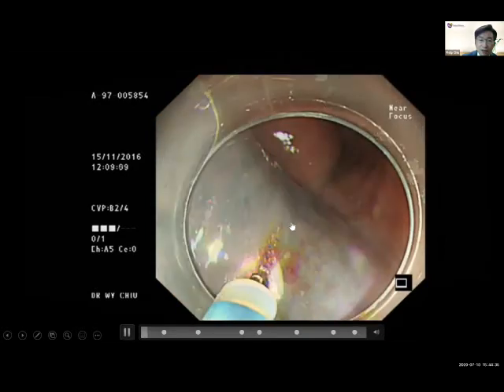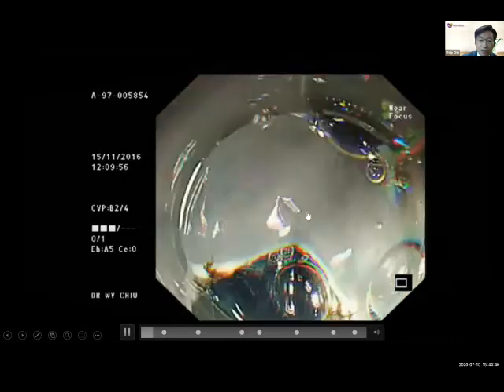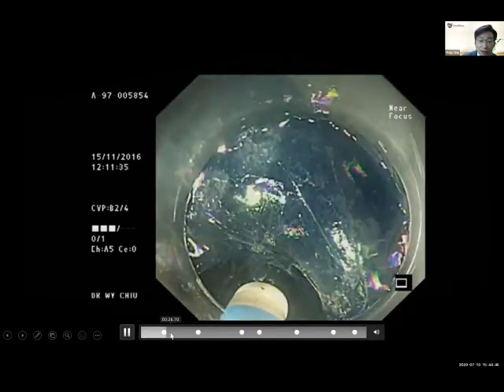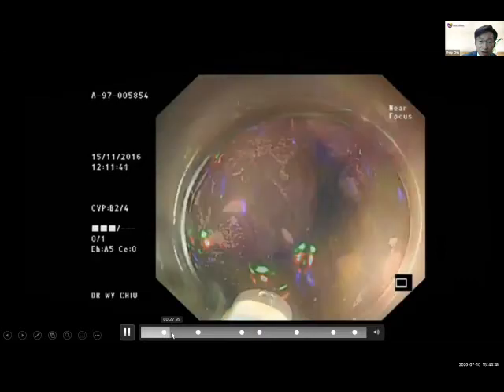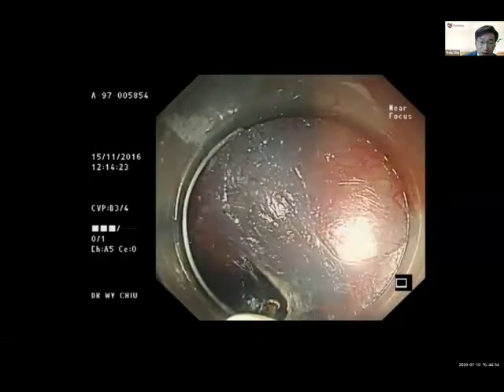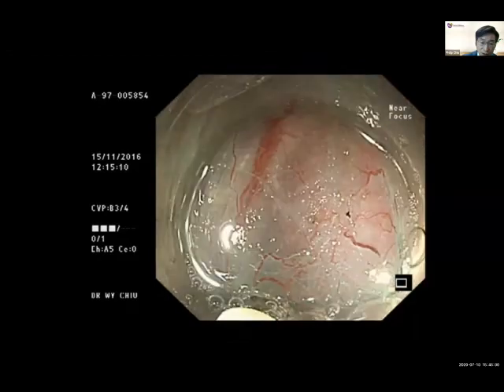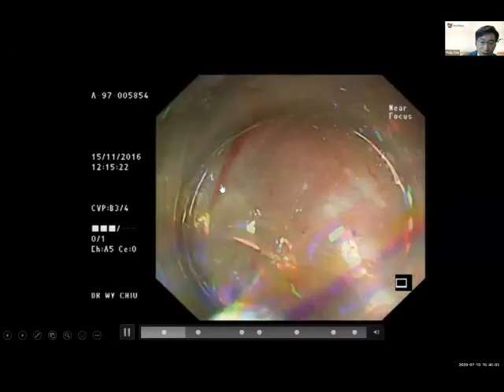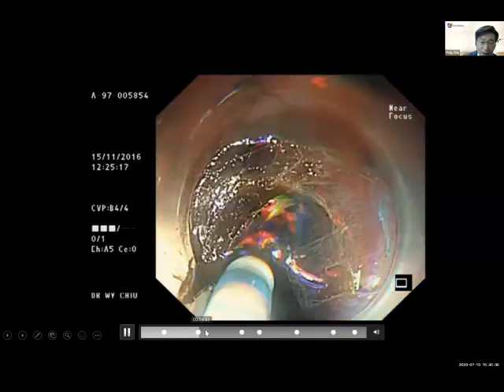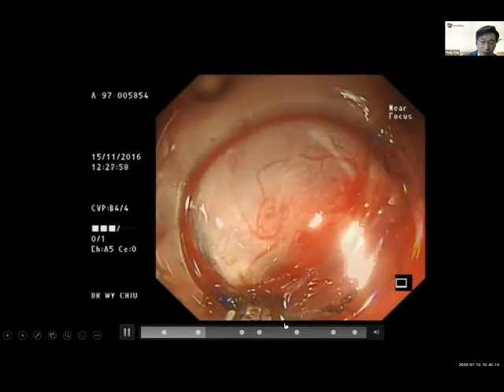This is one of the videos to show you how we perform it. It is an esophageal leiomyoma, and we developed the submucosal tunnel 2 centimeters proximal to the tumor, the same as the POEM. After dissection of the tunnel, we will be able to reach the submucosal tumor. After reaching it, we continue the dissection around the tumor to ensure a good border of dissection. This is the submucosal tumor while it is adherent to the muscularis propria layer. Further dissection will be performed around the tumor to develop a tunnel in the surrounding.